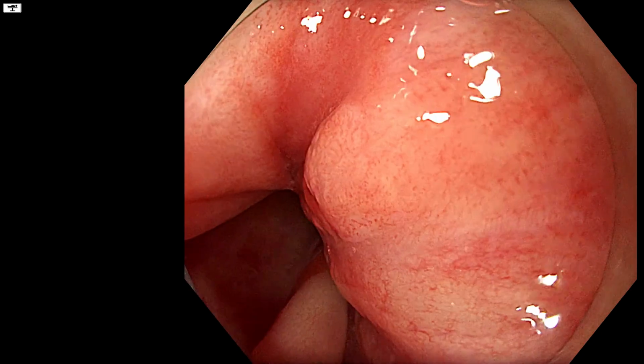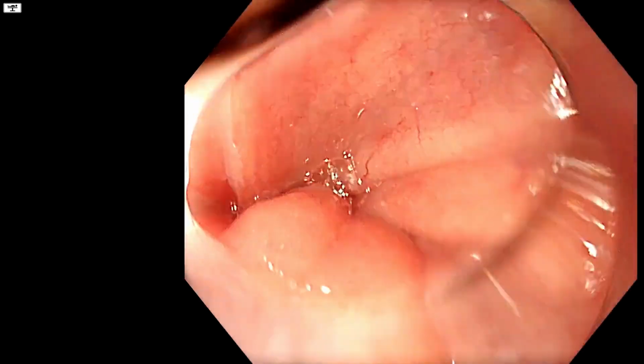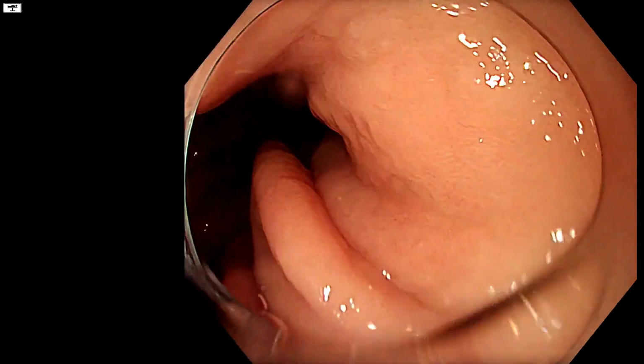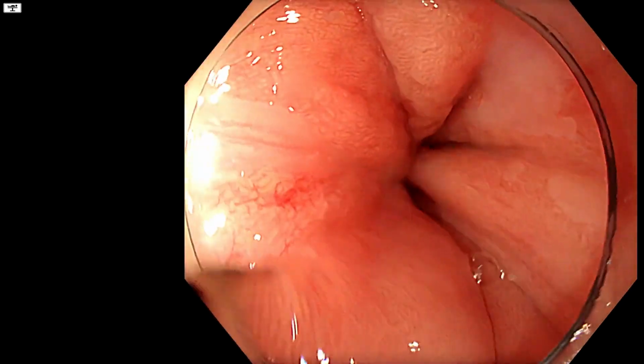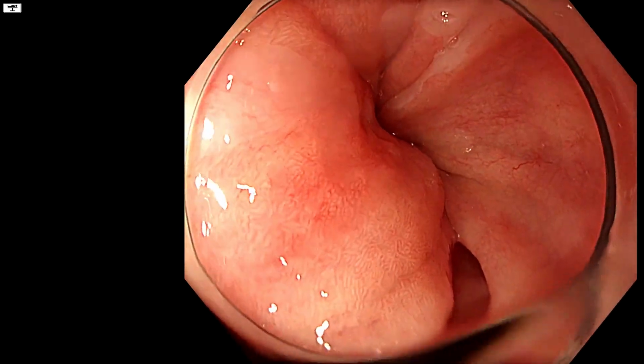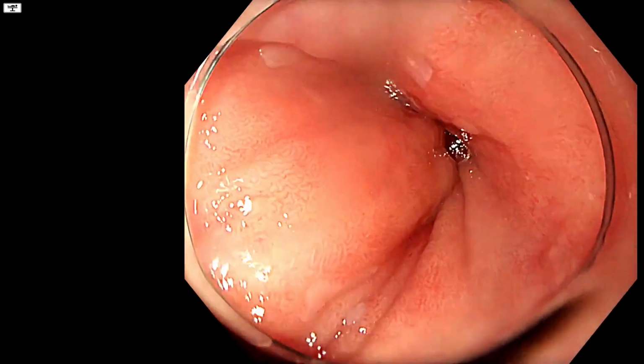So welcome. It's not something that you see very often. So the gastroscopy EZ1500, a patient who is relatively elderly, had a gastroscopy for reflux type symptoms and has got a Barrett esophagus. And you can see that here clearly.